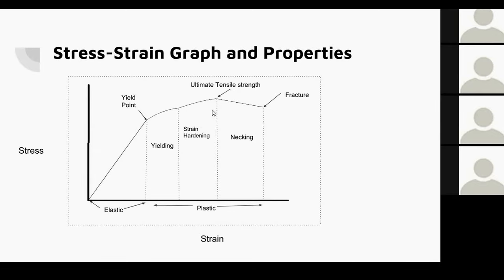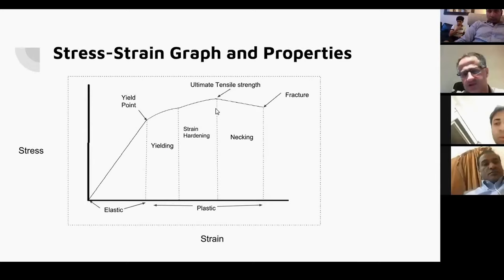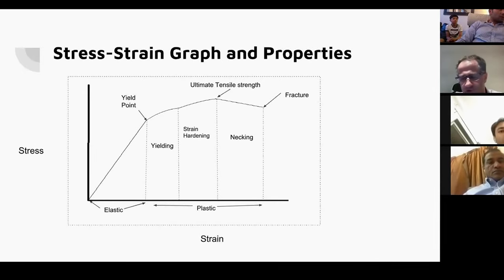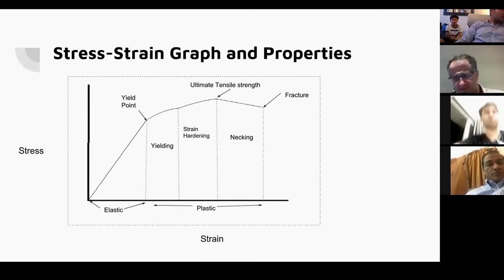This is important to know because this is in cold welding steel, cold working of steel. This is where you can get ultimate tensile strength in your prosthesis. So you can cold work this. What this does is it creates the molecules within your stainless steel to align up more well, and to prevent defects, and to create a more compact spacing of the molecules together.